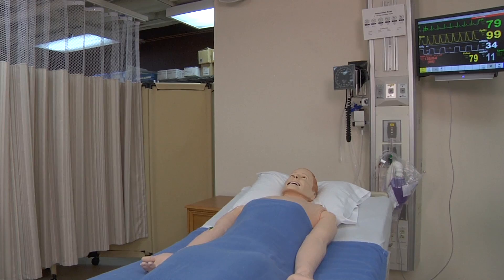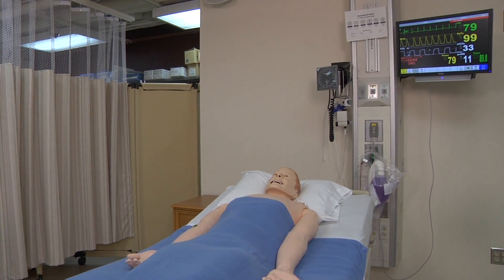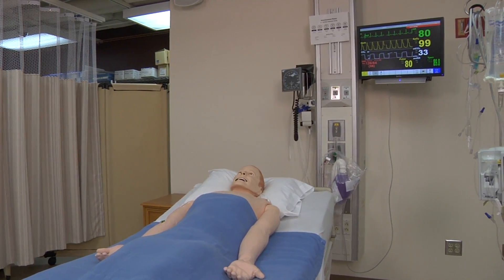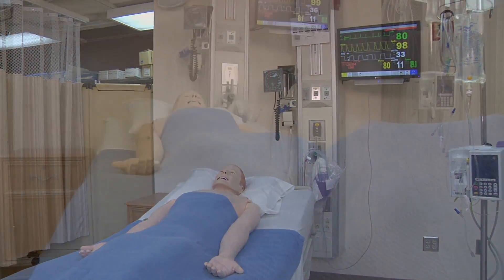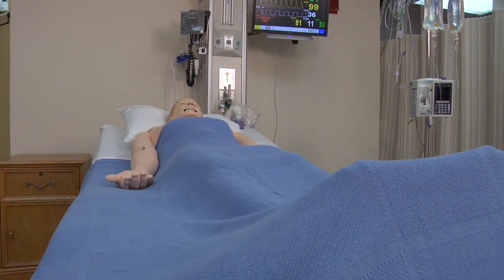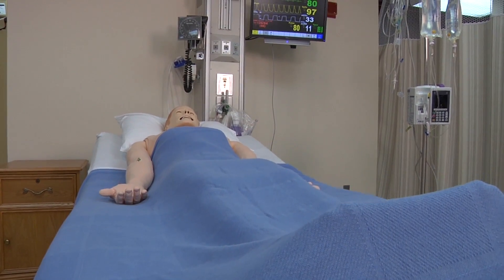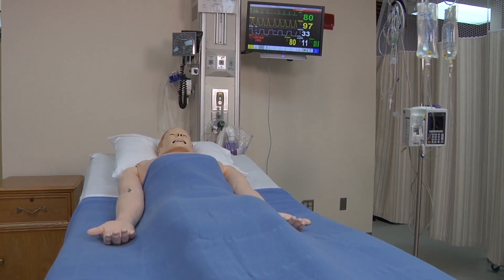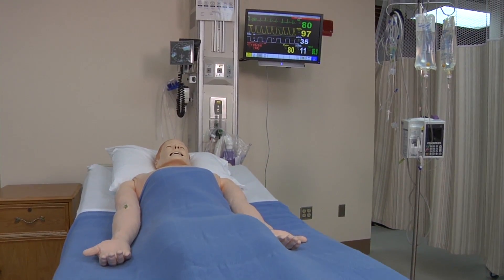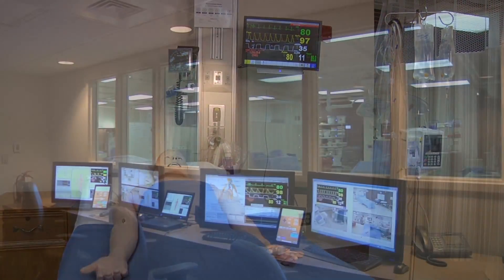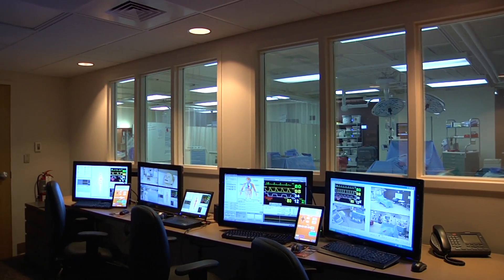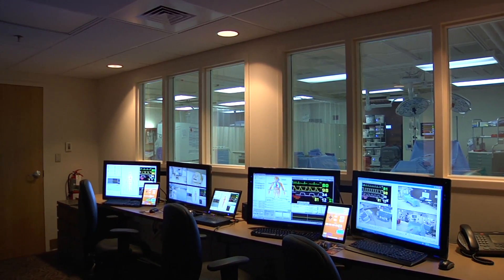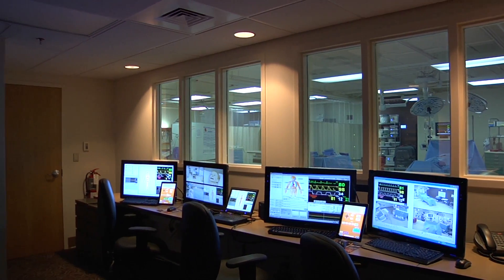SimMan 3G is a full-body mannequin patient simulator at the University of Tennessee Medical Center and the UT Graduate School of Medicine. The simulator can be controlled by an operator in the control room or programmed to a full scenario without operator intervention.